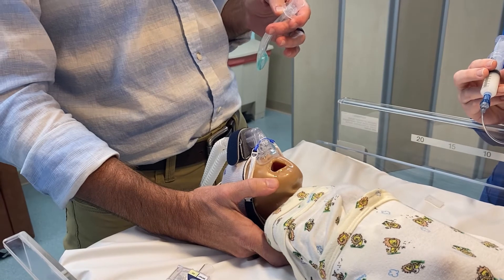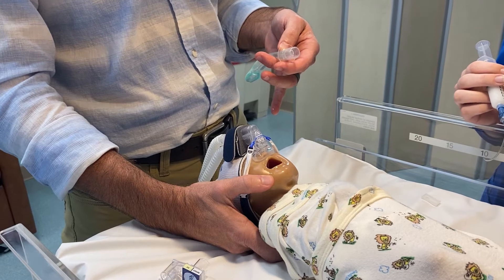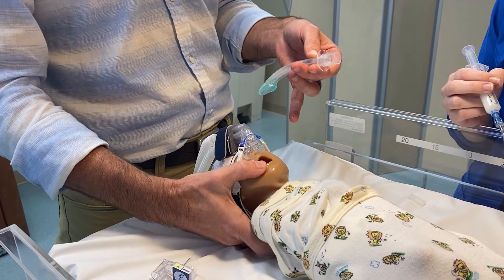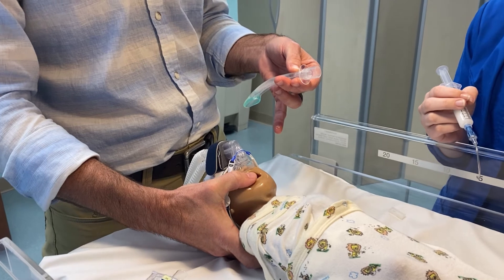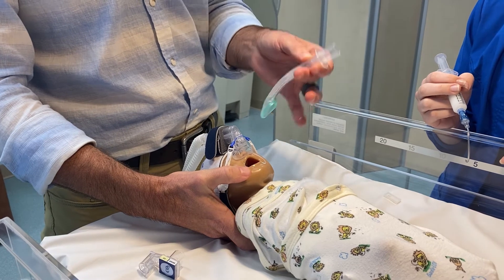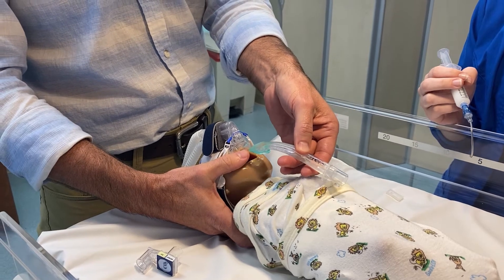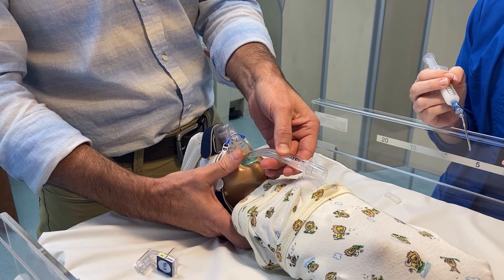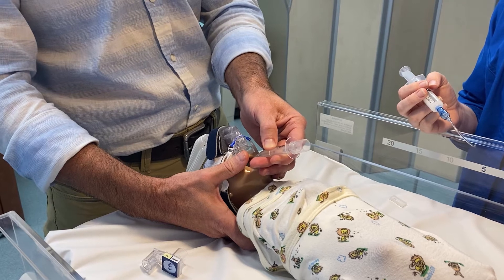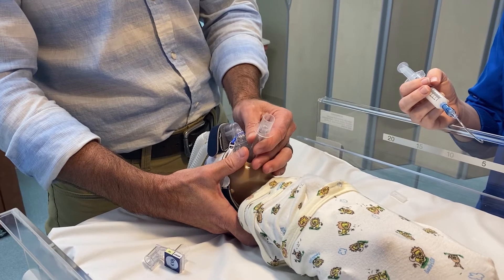Leave the CPAP in place as you do this — you don't need to remove the CPAP, that's just an extra step. If the baby has an OG tube in place, which typically they would while receiving CPAP, you can remove it or choose to leave it. Open the baby's mouth and take your finger to stabilize the tongue. Typically there will be secretions in the baby's throat and the device will go in easily. Begin with the device going toward the nose, then place it on the hard palate and push back. You may meet slight resistance at the back of the tongue — just continue pressing until it pops into place.